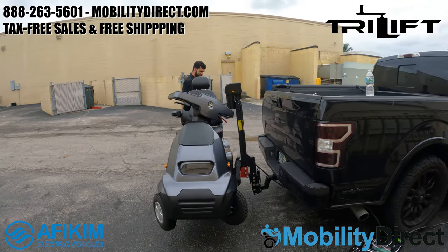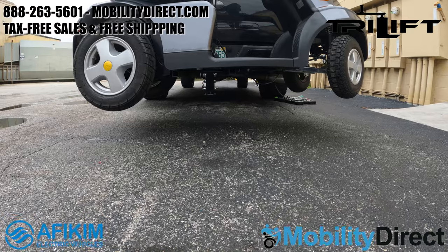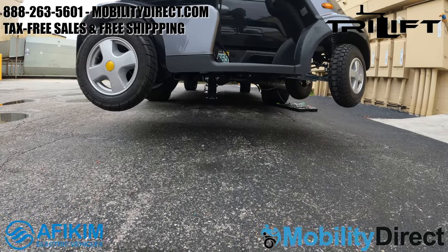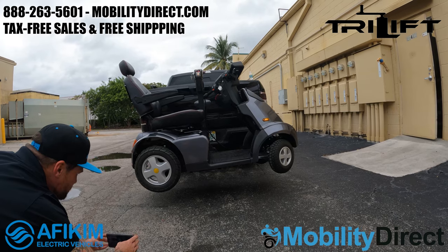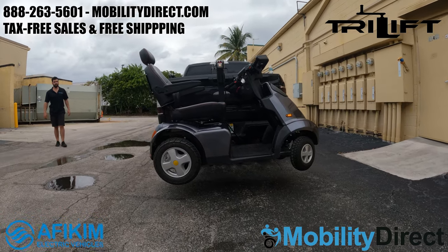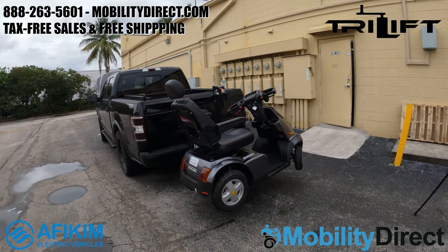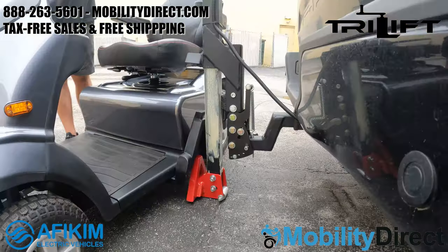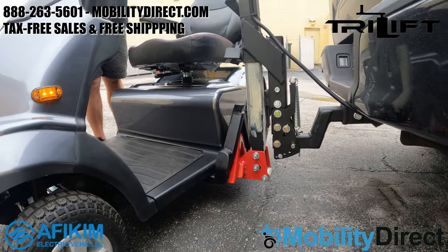This is a 300-pound-plus mobility scooter being lifted automatically. There is a drop adapter installed for demonstration purposes — in this particular truck setup you don't actually need the drop adapter. With the drop adapter it sits a little low to the ground, but without it the scooter would sit up about four inches higher, completely out of the way of any speed bumps or obstacles.